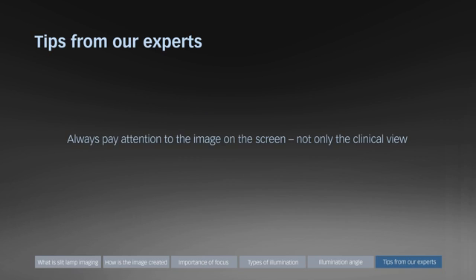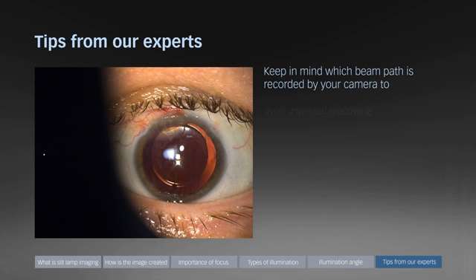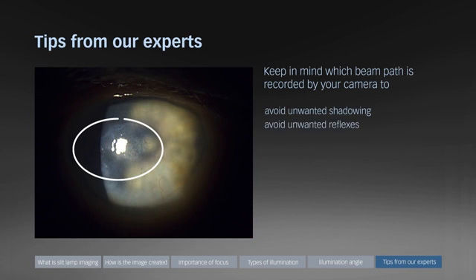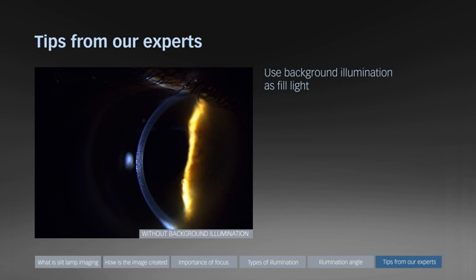Always pay attention to the image on the screen, not only the clinical view. Keep in mind which beam path is recorded by your camera to avoid unwanted shadowing and unwanted reflexes. Add background illumination to improve the orientation within the image.